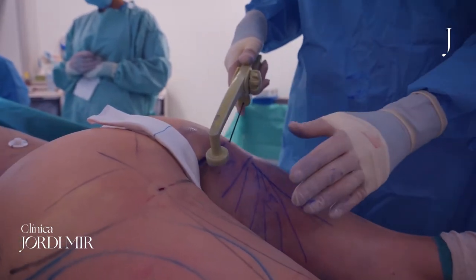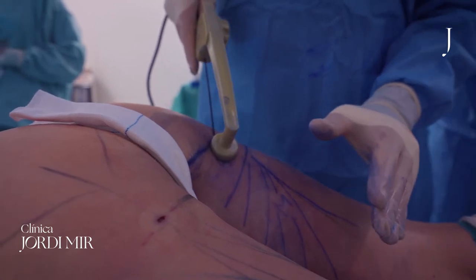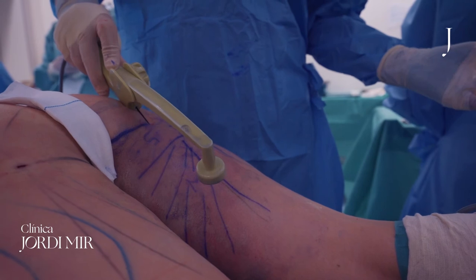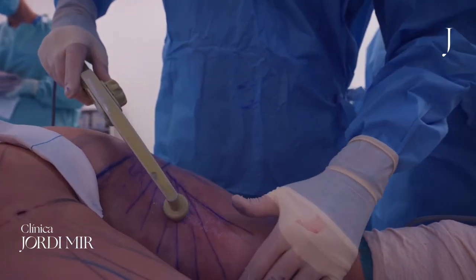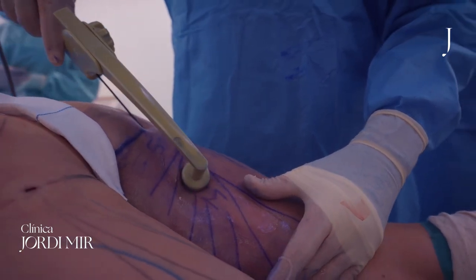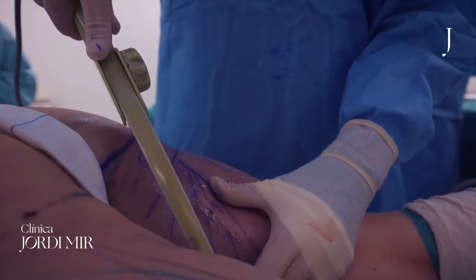Technically, the stamping is this — a tapping motion — and the moving is moving. A little bit more of Vaseline. We move at a speed of about one centimeter per second. We have to maintain the temperature. We are working at a center temperature of 70 degrees Celsius and an external of 40 degrees Celsius — this is what we usually work at.